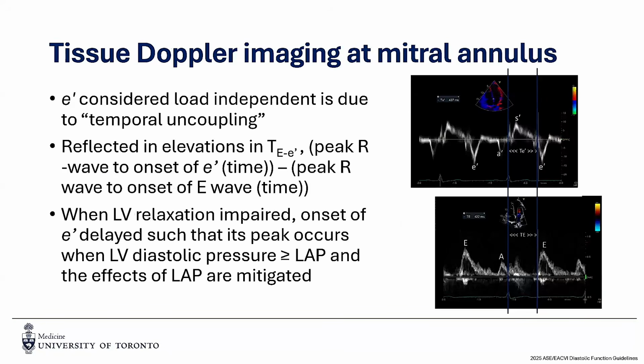Okay. Now, this is another topic that I just wanted to spend a little bit of time on, because it took some time for me to understand why exactly the E prime is considered preload independent. And this is really important because we know, as we go through the later guidelines, that E prime is one of the first things that we look at when we assess for diastolic dysfunction.